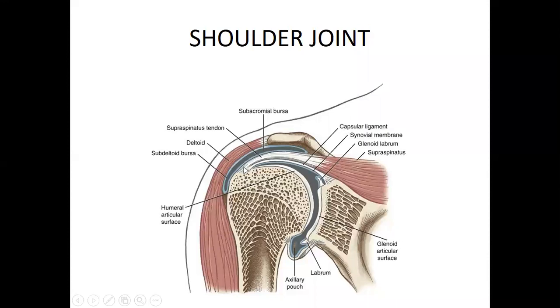So the key lesson here on this shoulder is to realize that the four muscles that we have all originate from the scapula. Three posteriorly, one anteriorly, they come and join together to form the rotator cuff, which is the band of tendons. And this is the center of our discussion. So really understanding the anatomy involved in the shoulder joint will help us to comprehensively evaluate this shoulder ultrasound that we are discussing.